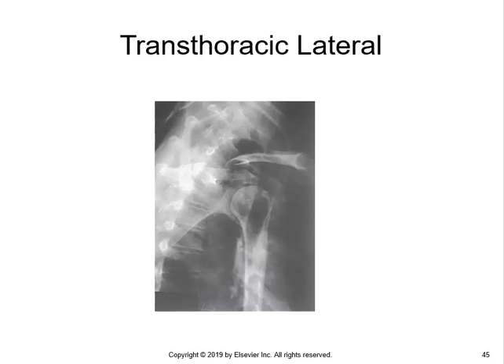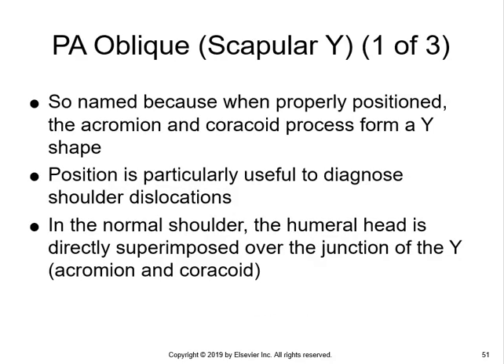In class this morning, we skipped from the transthoracic Lawrence method down to the scapular Y view because there are some specifics about the Y view that I wanted to communicate, some of which really aren't touched well on the test, and where we can use the Y view instead of the transthoracic. So I want to go ahead and show the slides.